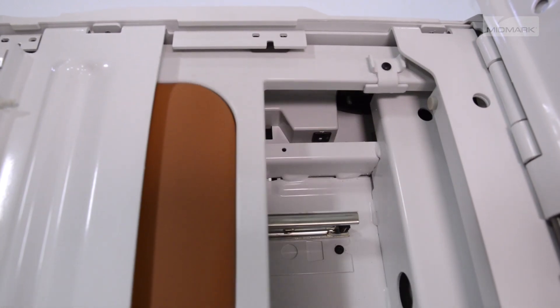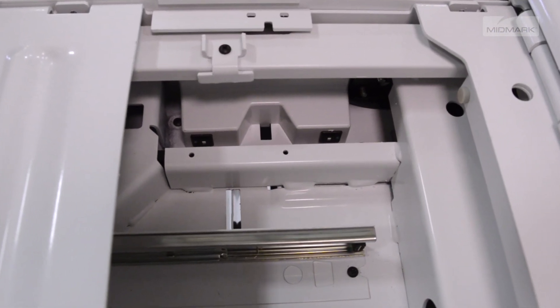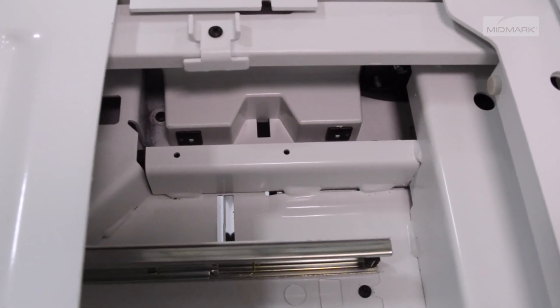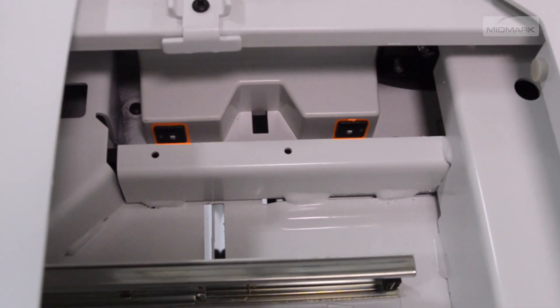There are two circuit breakers located under the seat section. If the receptacle's maximum load is exceeded, the circuit breakers interrupt power to the receptacle. To reset the circuit breaker, push the circuit breaker switch.